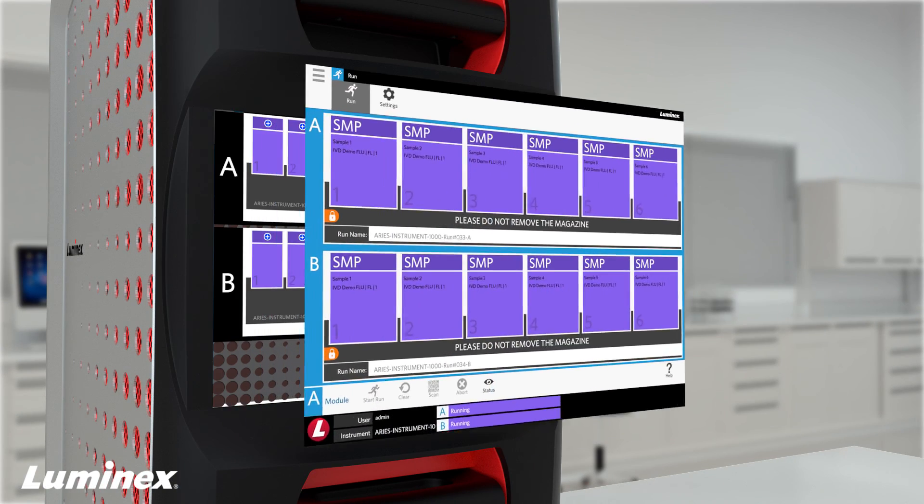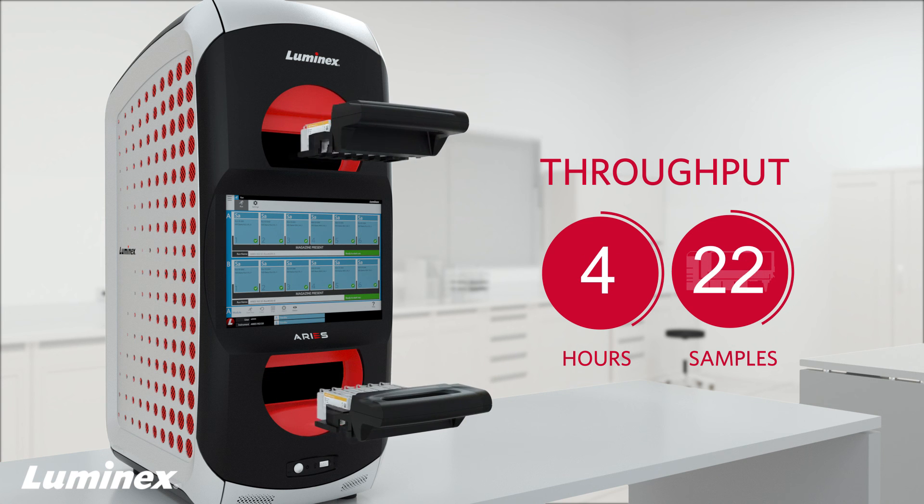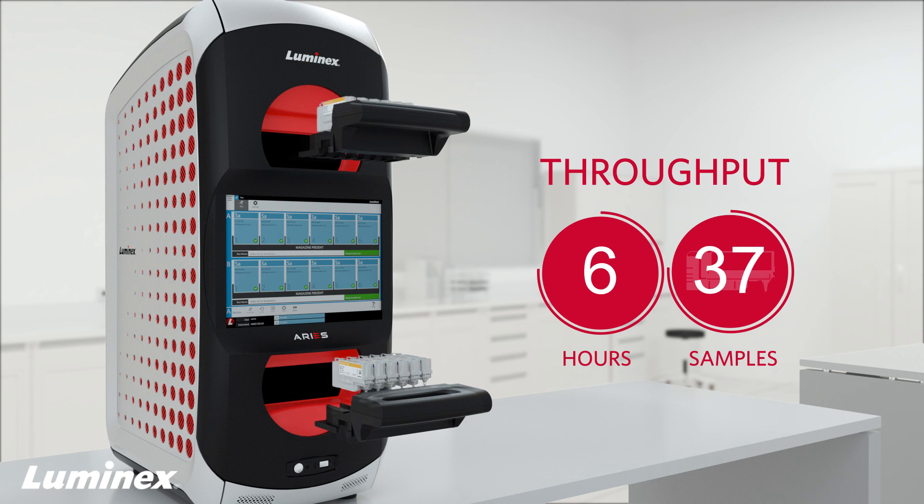Ares touch screen display clearly shows the status of each run, which takes about 2 hours for 1 to 12 IVD assays. Up to 48 samples can be run on a single instrument in an 8-hour shift.